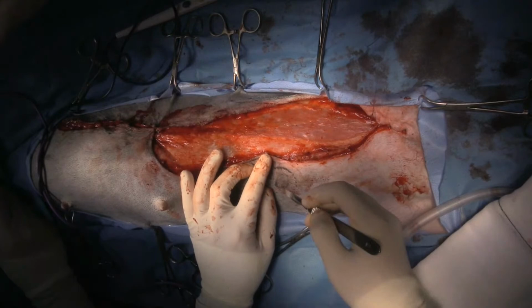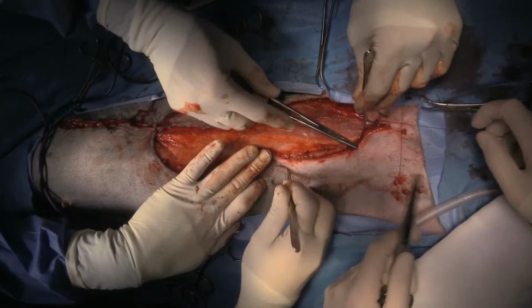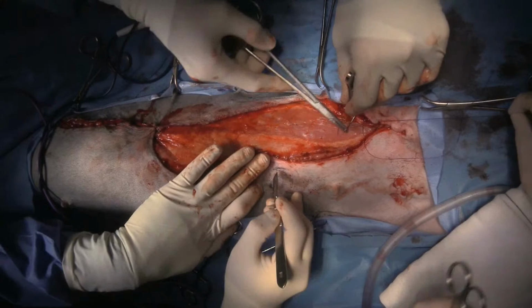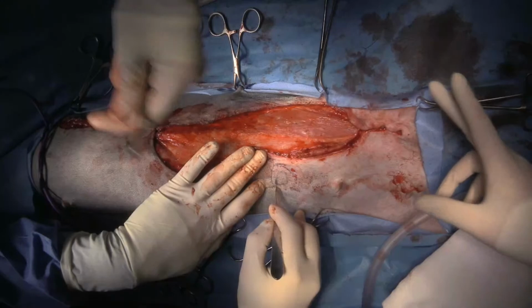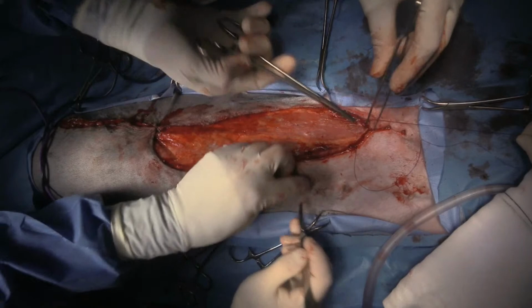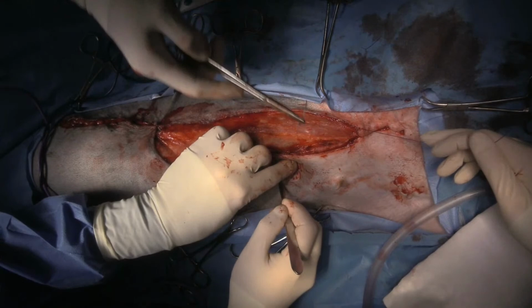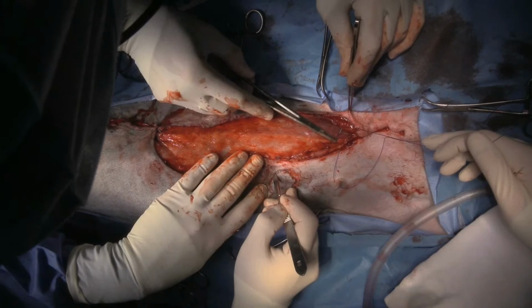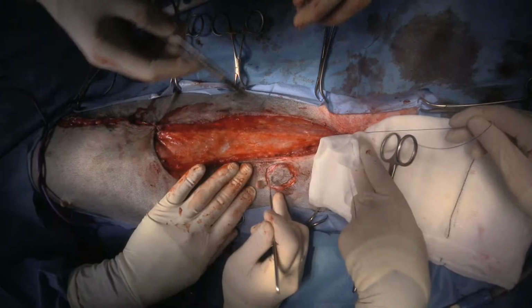Do you want to come around this side? Yeah, of course. Just in here would be fine. That's fine. Yeah, just push the table away. You can use cautery. So you don't have to go all the way down to the body wall.